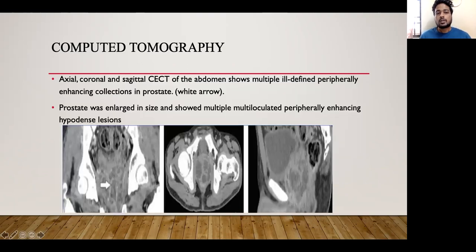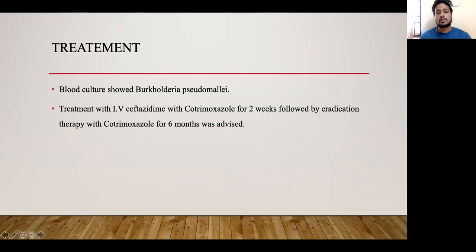Axial, coronal, and sagittal CT images of the abdomen showed multiple ill-defined peripherally enhancing collections in the prostate. The prostate was enlarged and showed multiple multi-loculated peripherally enhancing hypodense lesions. Blood culture grew Burkholderia pseudomallei. The patient was treated with IV ceftazidime and co-trimoxazole for two weeks, followed by eradication therapy with co-trimoxazole for six months.